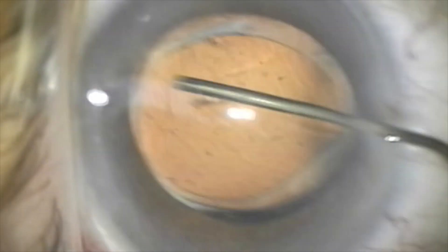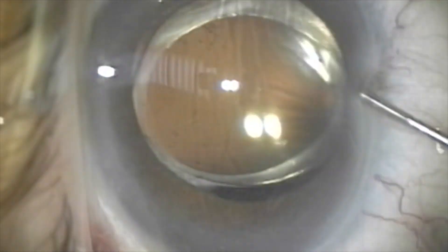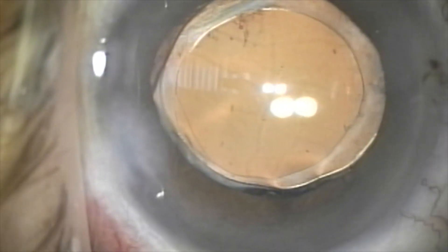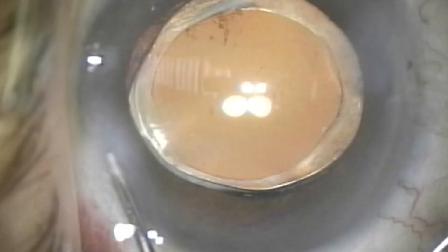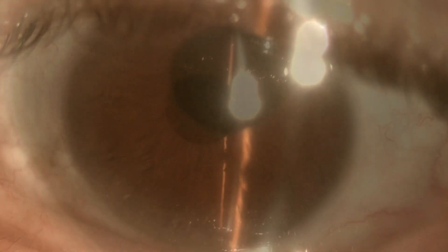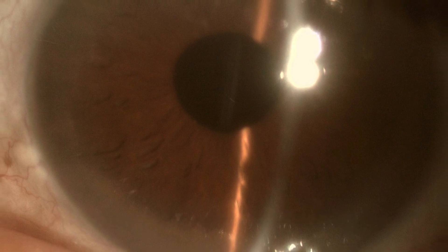In conclusion, the capsular bag can be reopened easily after 10 years of the primary surgery. Irrigation and aspiration can be a safe alternative to treat late capsular block syndrome. On post-operative day one, the eye was quiet with a clear capsular bag, and vision was regained to a best corrected visual acuity of 20/20.